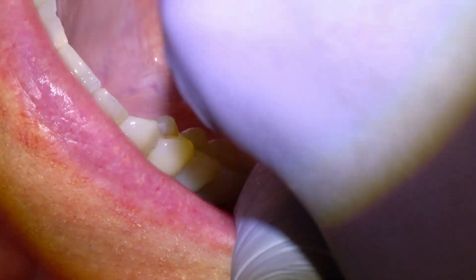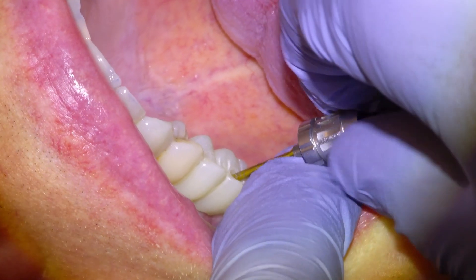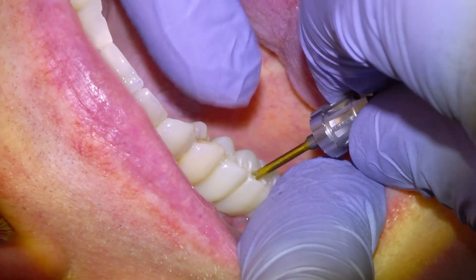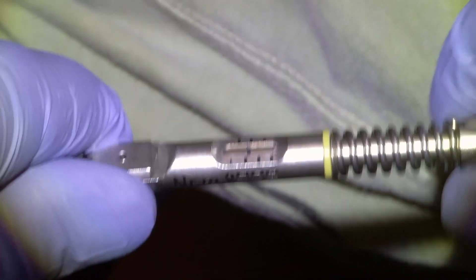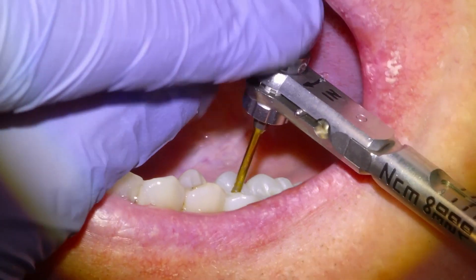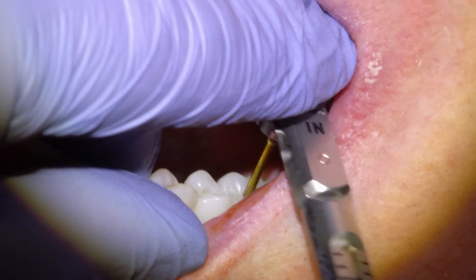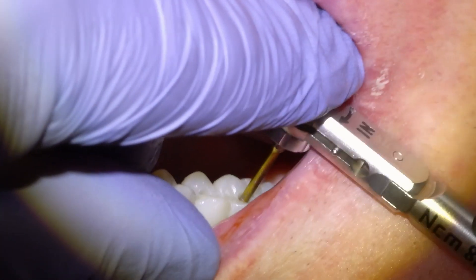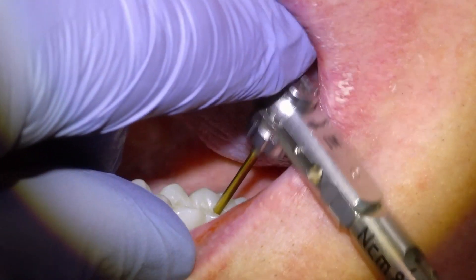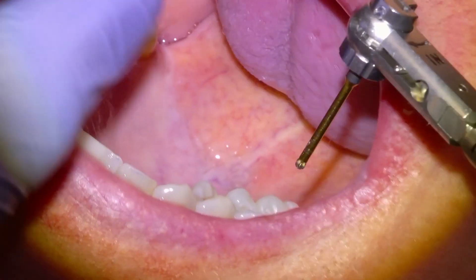I'll just take a moment to thank our patient here who allowed me to share this footage for the purposes of education and entertainment, and just kind of showing what we as dentists do on a daily basis. So this is our torque wrench — we're going to tighten our screws down to the specified torque level. It has a little brake action that breaks once it's reached the torque level, and then we'll adjust to the proper tightness, which is 35 newton centimeters, and tighten it down the rest of the way.